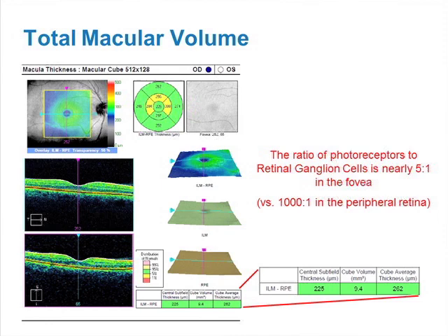However, also on this report, there are 3 sectors which are identified as somewhat thinned. That is, they show up yellow with the numbers 284, 296, and 300. Again, we get the sense that there are some subtleties in these numbers which show that some sectors of the macula may be somewhat thinned, perhaps as a result of prior optic neuritis, even if it was mild and potentially even subclinical or not noticed at the time by the patient.